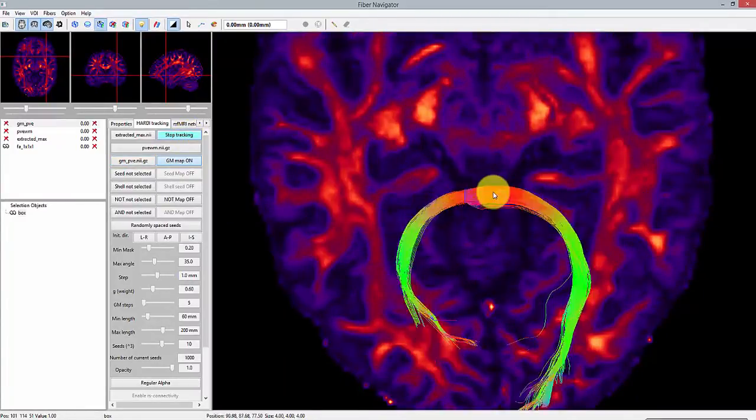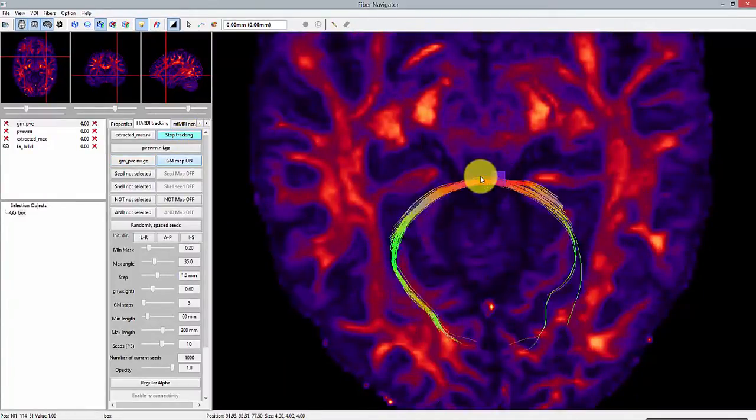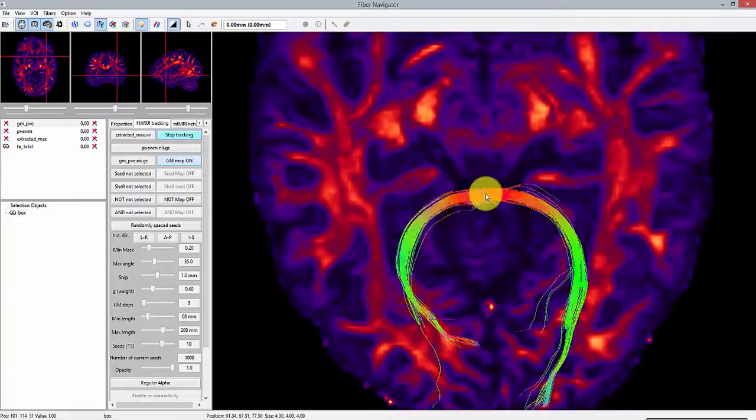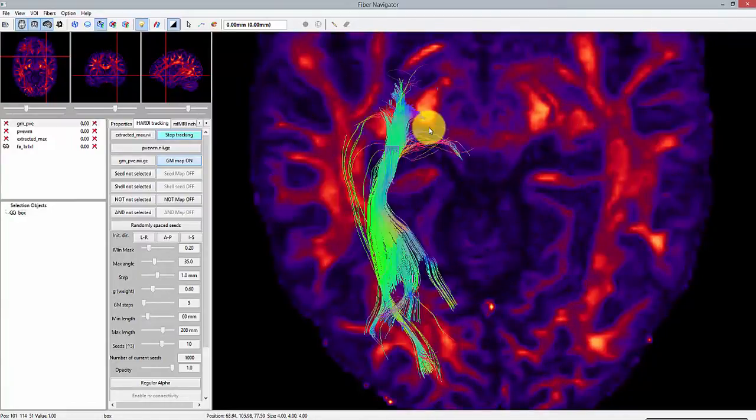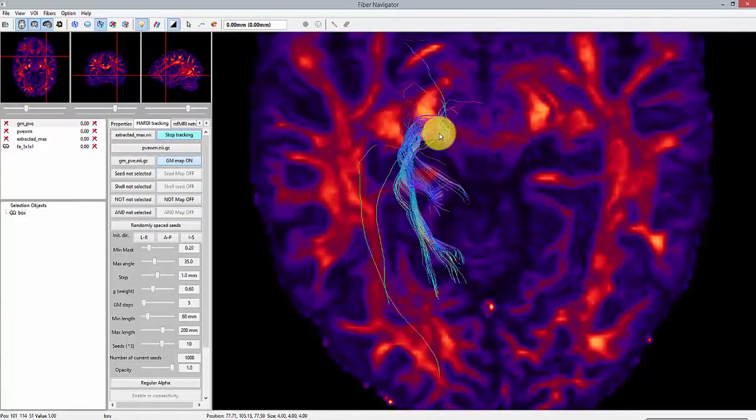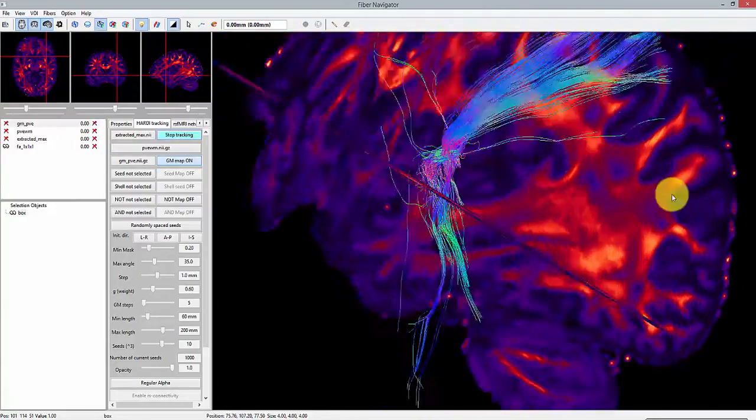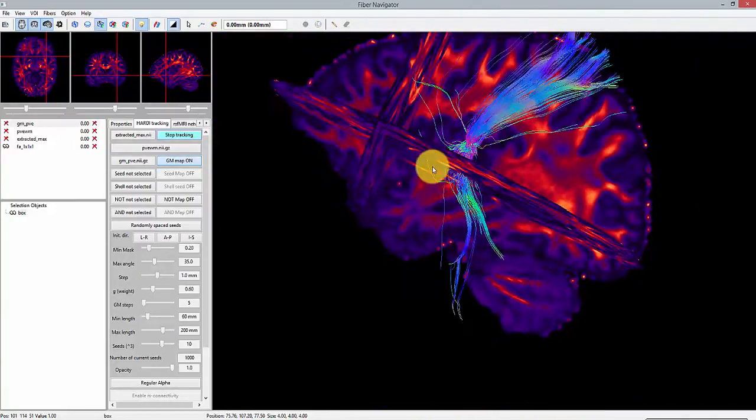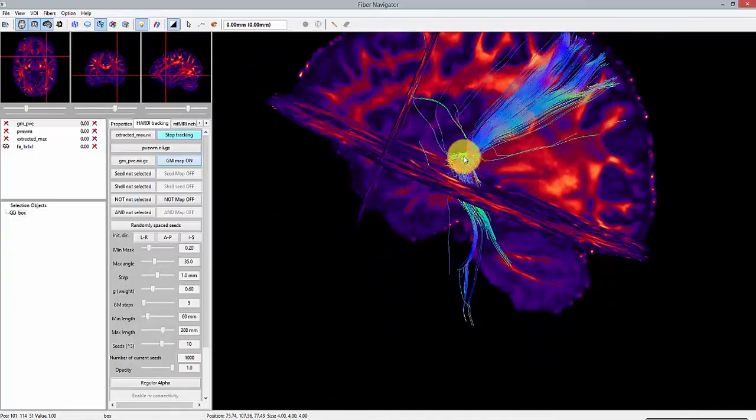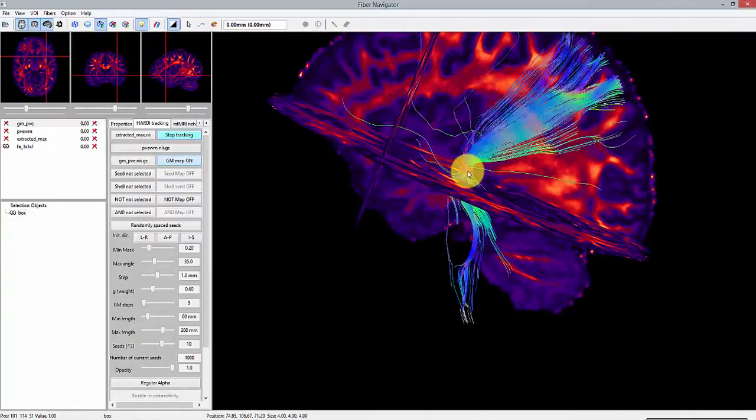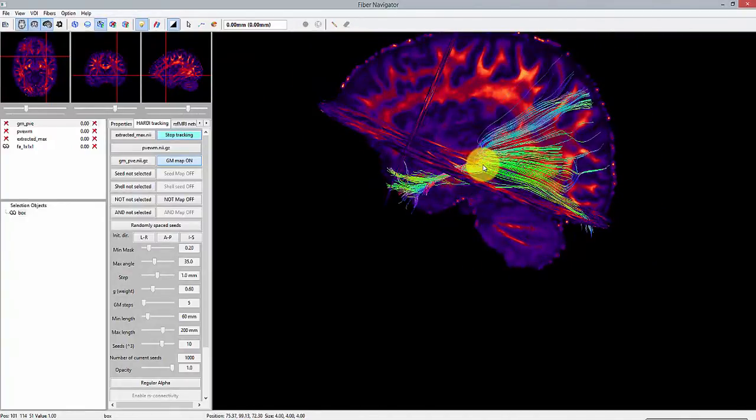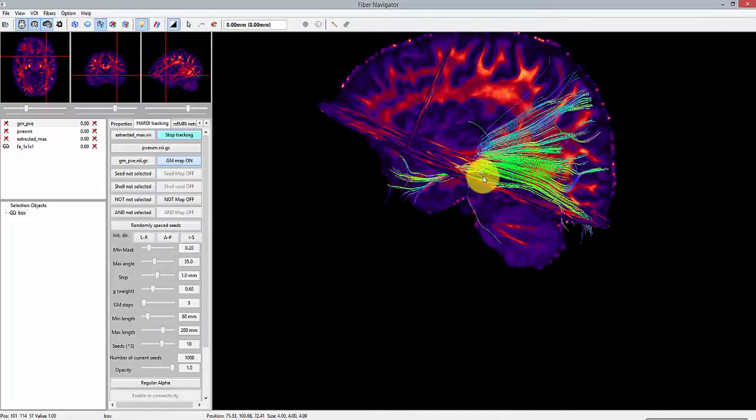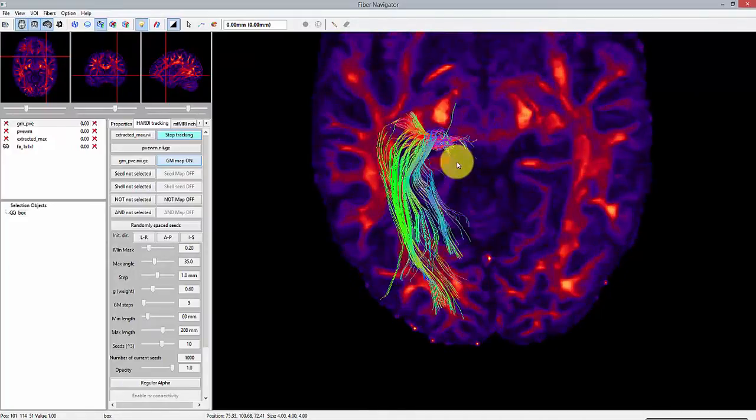Feel free to move the box around and explore the structure or connectivity. Please note that streamlines are computed in real-time from the seed ROI. This means that you can have access to the tracking parameters on the left and directly see the effect on the tracks.